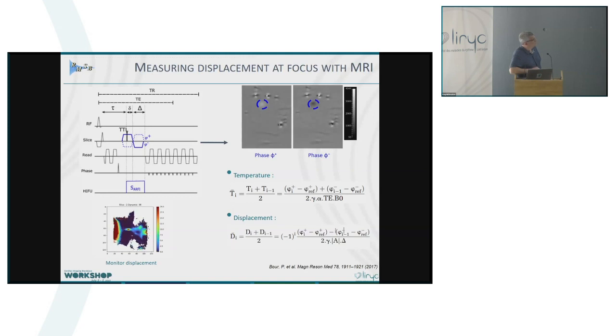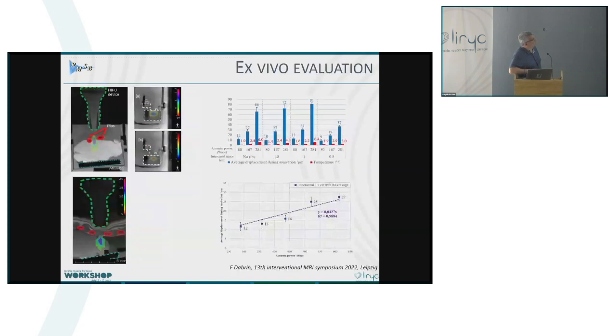These big red things that you see here are because you have a change in the impedance. This is a gel. You have the impedance there, and you have a reflection of the push there, and this is simply an artifact. This was a sequence and a method published a few years ago, and we are now working with Nadège Corbin to implement a much faster acquisition method.